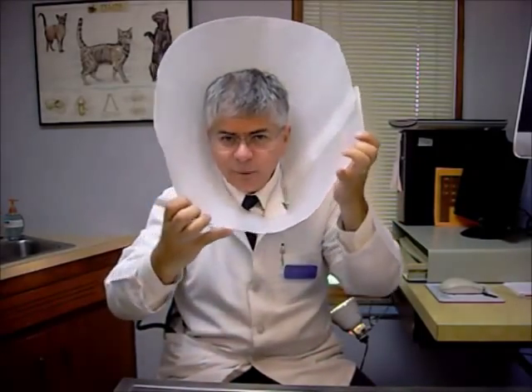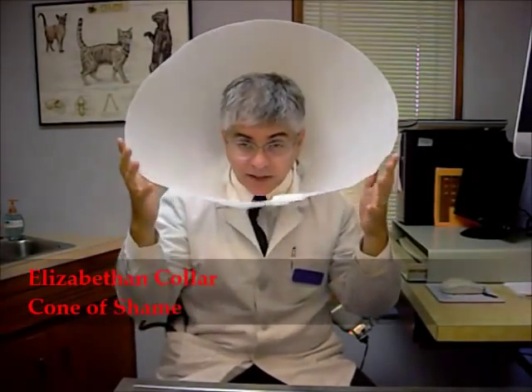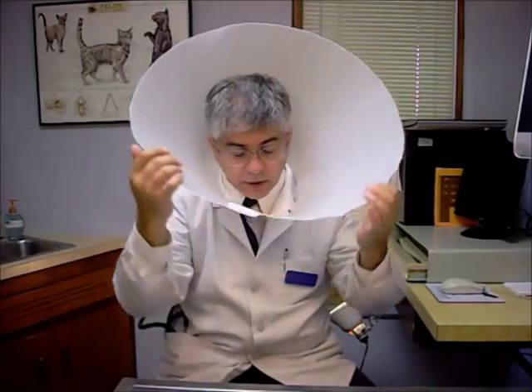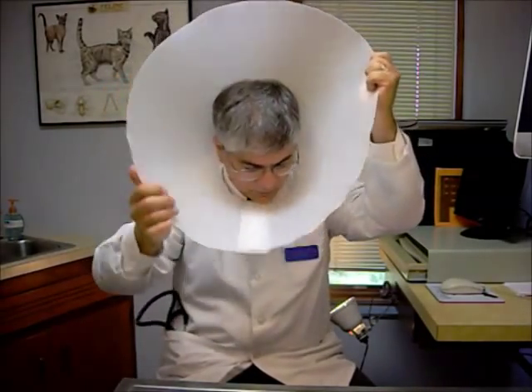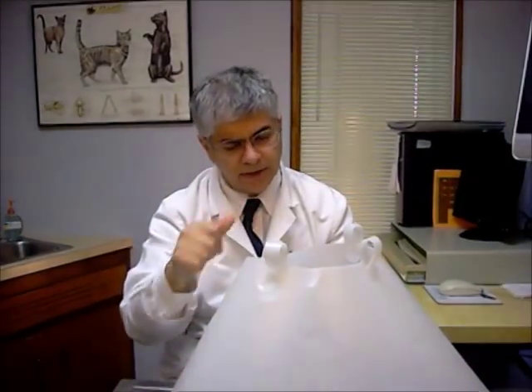So how do we put this together and how do we adjust it? This is kind of hard to see around and it echoes a bit, so it can be a little distracting as you get used to it — which is why it doesn't surprise me that your pets may take a little time. But there are ways to adjust the size. If it's too big or small, there are little areas here, and I'll show that as we take this off.